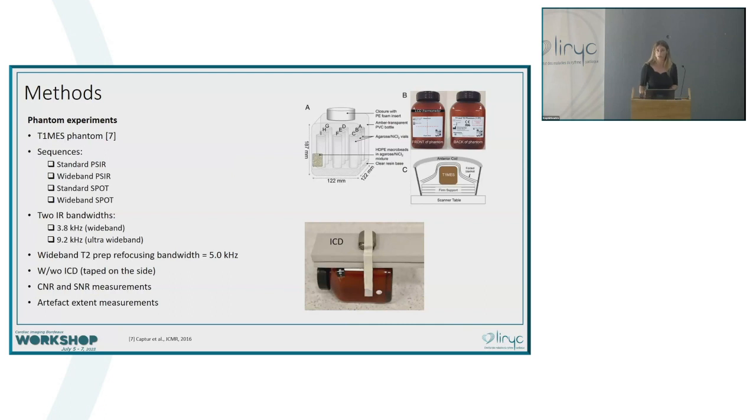Our reference is the phase-sensitive inversion recovery, where we only have an inversion pulse, and also the wideband inversion recovery, followed by the SPOT technique, standard and also wideband. For the inversion pulse, I implemented the 3.8 kilohertz value as proposed in the literature, which I named wideband, but I also tried 9.2 kilohertz, which I named ultra wideband.